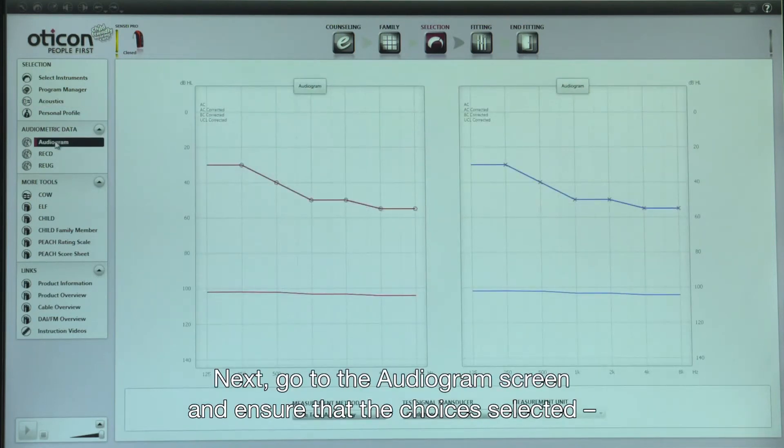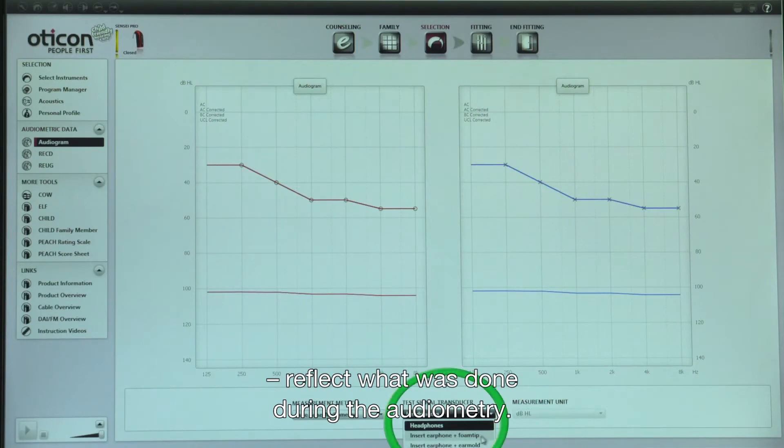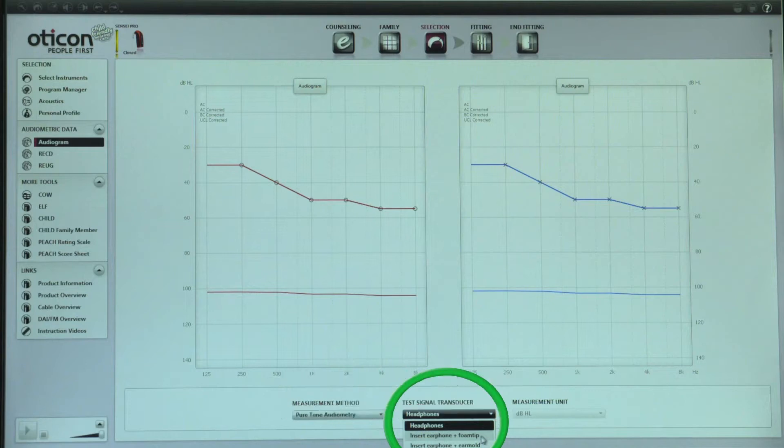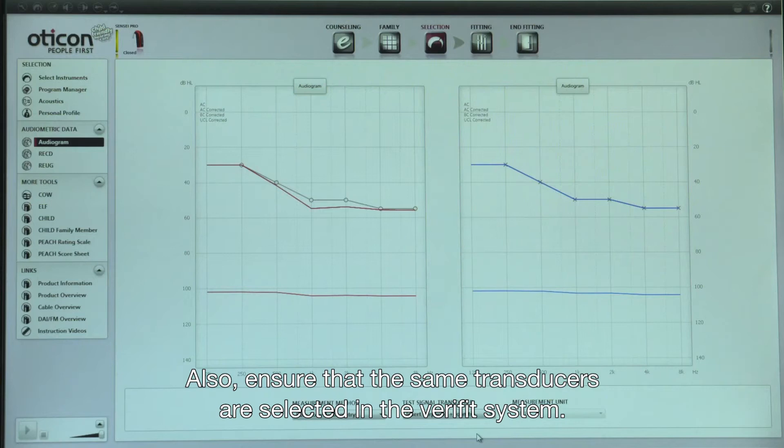Next, go to the audiogram screen and ensure that the choices selected reflect what was done during the audiometry. Also, ensure that the same transducers are selected in the Verifit system.